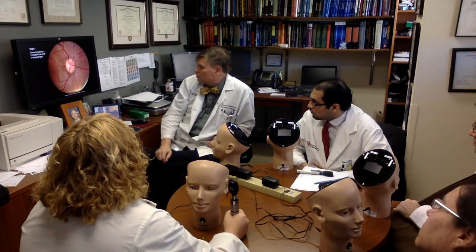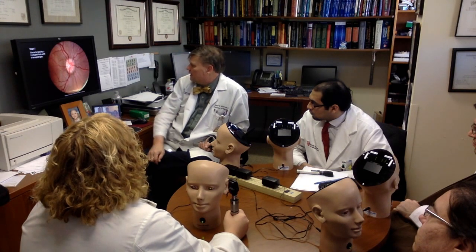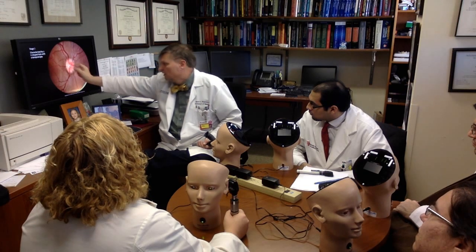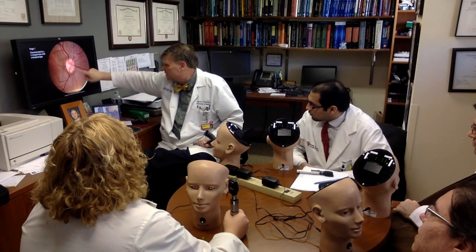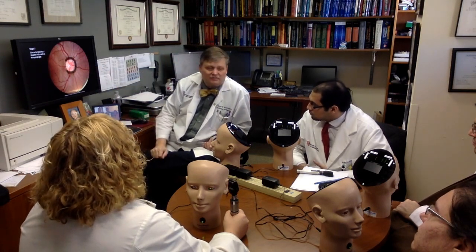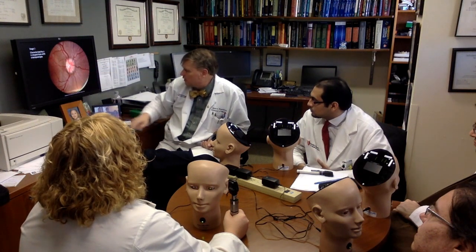Okay, so let's look at this one here. You look at this and say, oh, doesn't look too bad. But now let's look more closely, and you'll notice the physiologic cup is a little bit on the small side. You look at the disc right here, it's pretty sharp, right? But it's not so sharp here. It's not so sharp here. So this is like the inverted C. This is what happens in early papilledema, that the temporal is the last one to go.